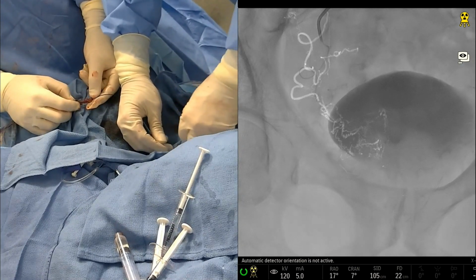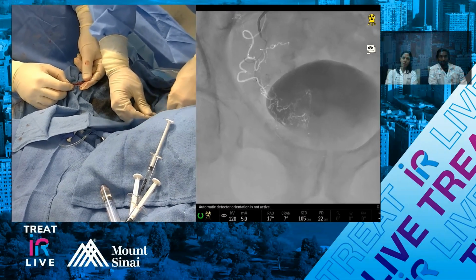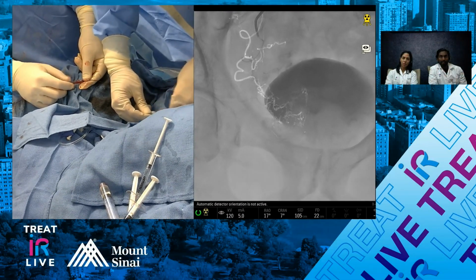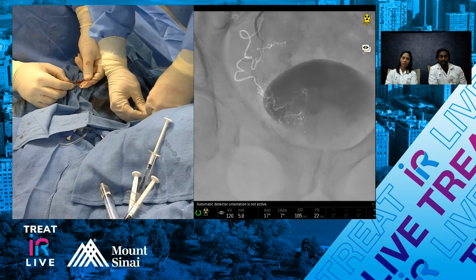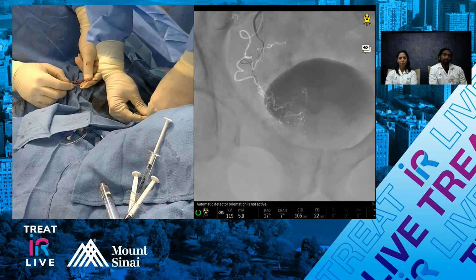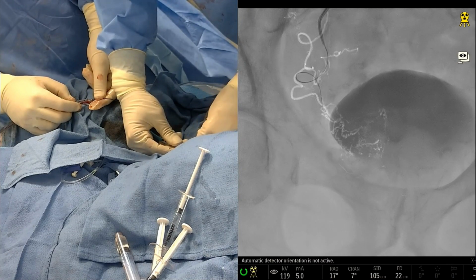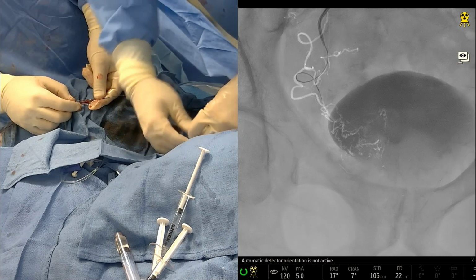Do you want to pull back the catheter a little bit? Yeah, a little. I don't know, I think it might be a little over for me. Once you get the wire in, you may be able to advance your base catheter sort of into the... Maybe. You can give it a shot. Yeah, we'll give it a shot. Maybe. We don't want to get greedy. We've got to make a turn here. That's the challenge on this one.